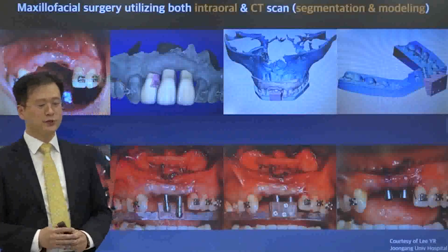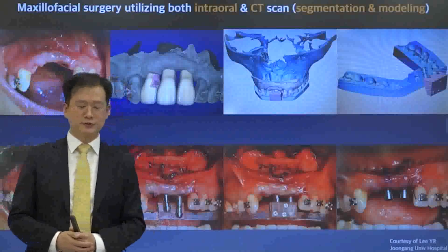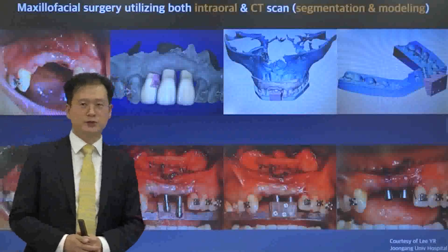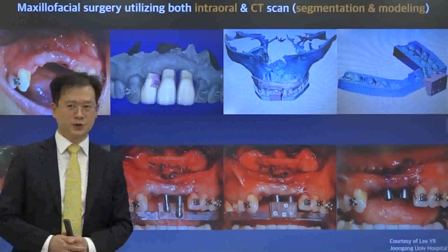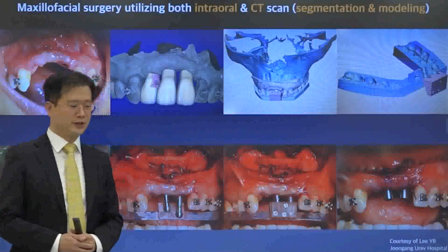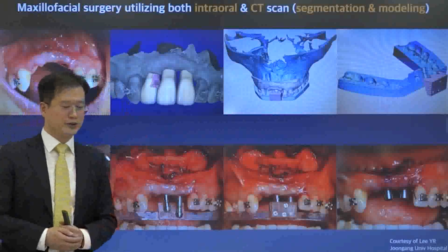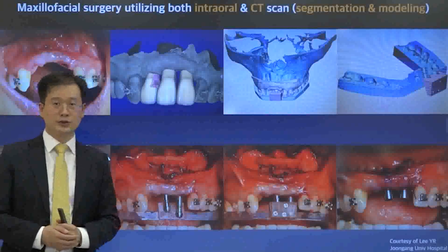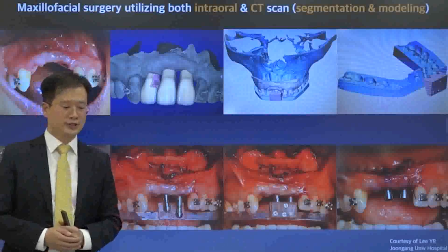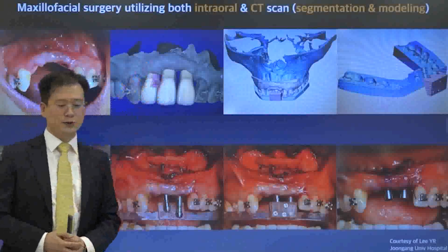Also, two implants in the wrong position could be surgically transferred with the help of a template designed on the 3D data extracted from CT. The location of the placed implant is poor. The treatment result will be unaesthetic like the 3D image on this photo.